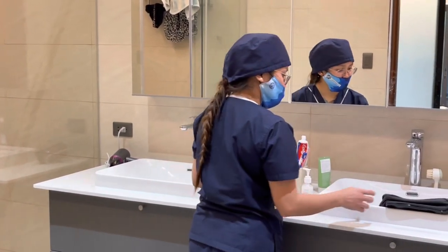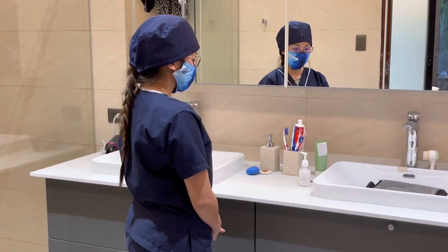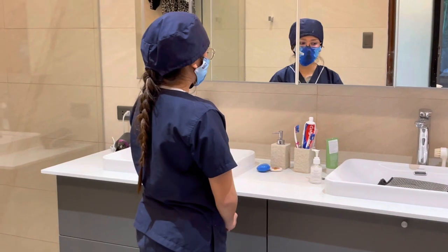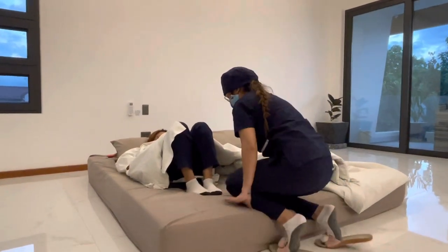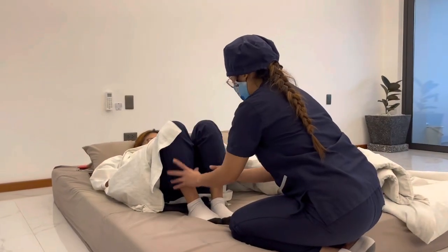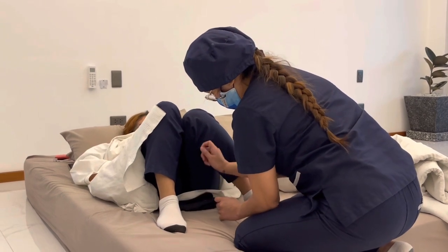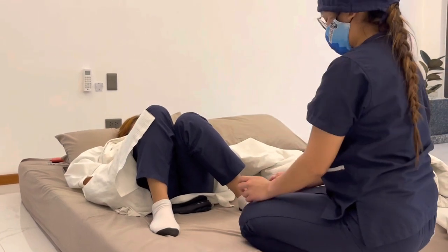For the culture and sensitivity test procedure, before obtaining the urine specimen, for a female, clean the outer urinary meatus of the patient with an antiseptic solution. Wear non-sterile gloves, and place the non-dominant hand on the labia minora and gently spread to expose the urinary meatus. Visualize the exact location of the meatus.